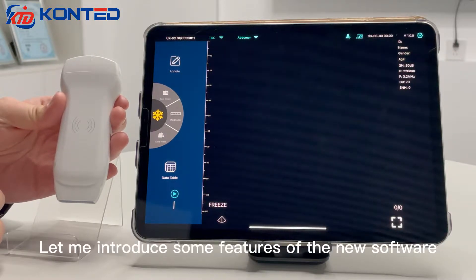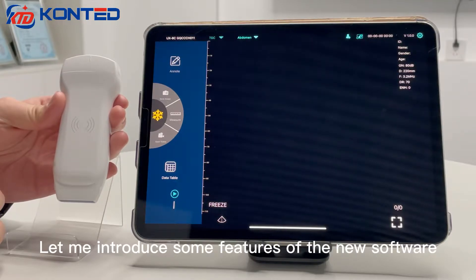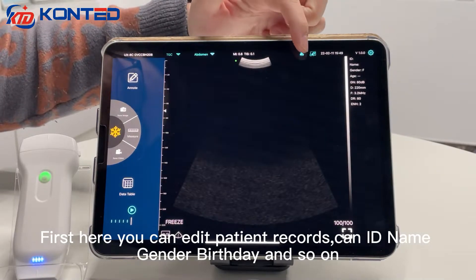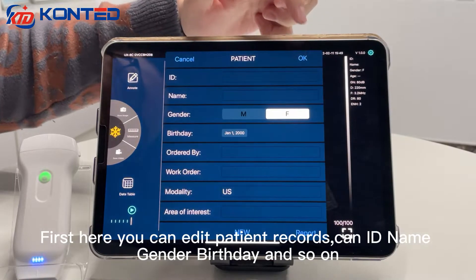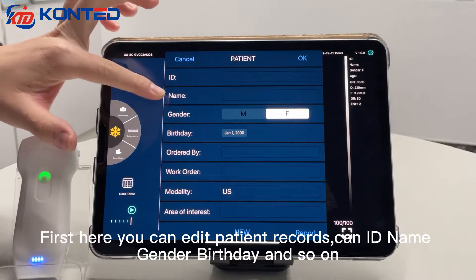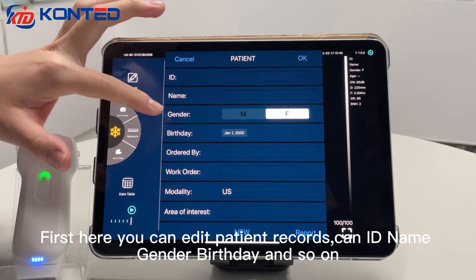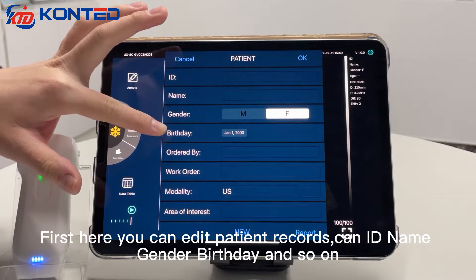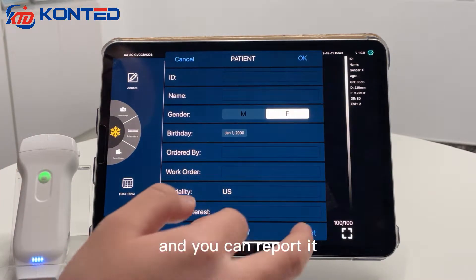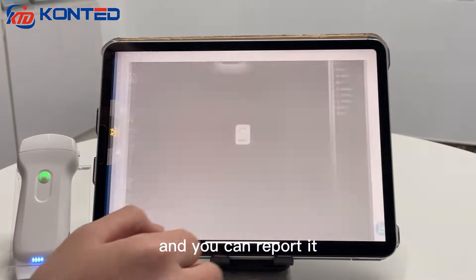Let me introduce some features of the new software. First, here you can add patient records. You can add name, gender, birthday, and so on, and you can generate a report from it.